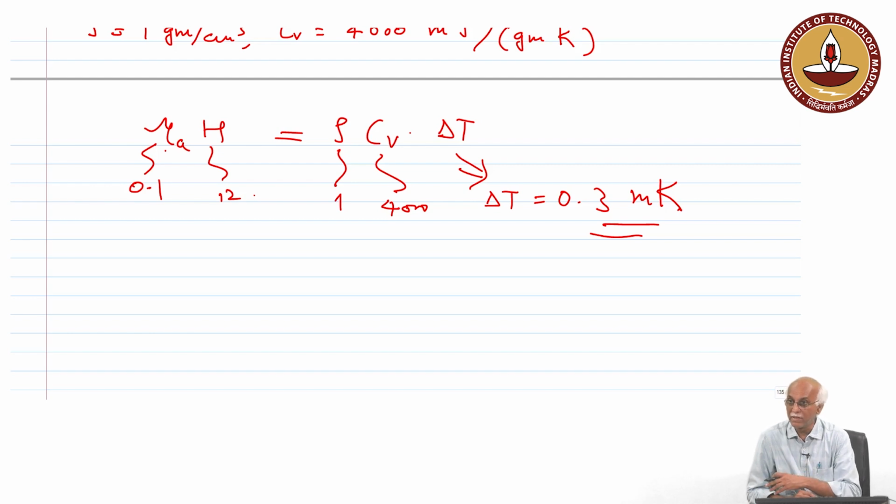That is why when we increase hot water temperature beyond 45 degrees centigrade, a difference of only 10 degrees centigrade, our tissue will start burning, correct. It is similar here also. So the energy absorbed will end up with a temperature rise of this very small level.